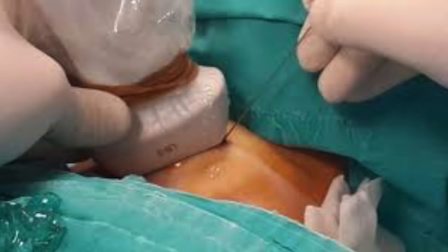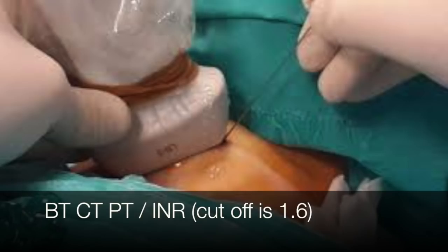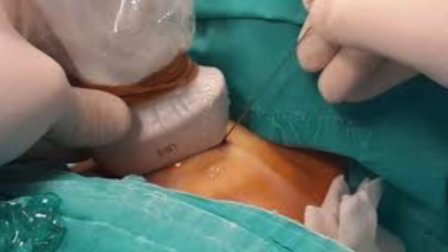Generally no obvious preparation is required for the patient except for shaving the concerned area. In deeper solid organ lesions it is imperative to do a bleeding or clotting profile including prothrombin time and INR. Always monitor vitals like pulse, BP and oxygen saturation before the procedure. Some people advocate giving injection atropine 30 minutes before to avoid vasovagal problems.